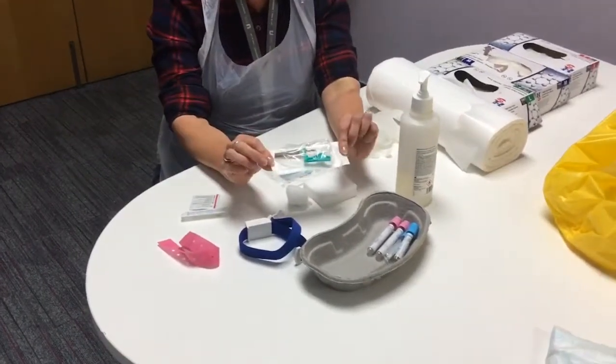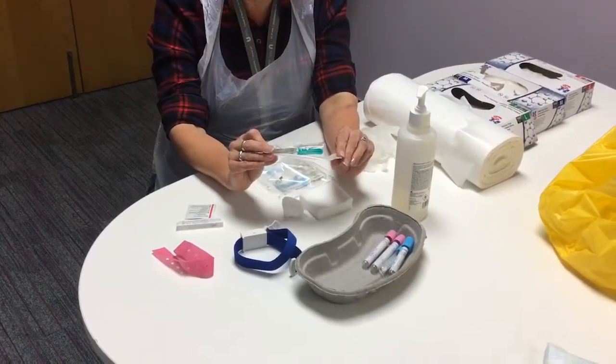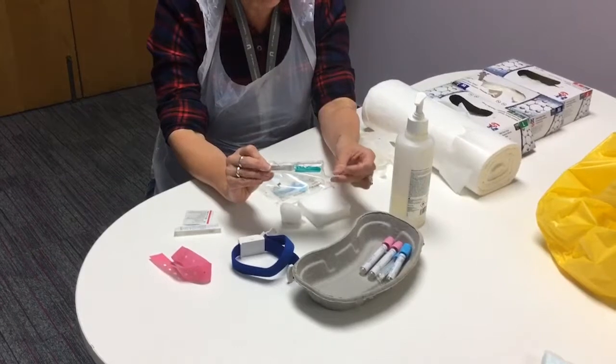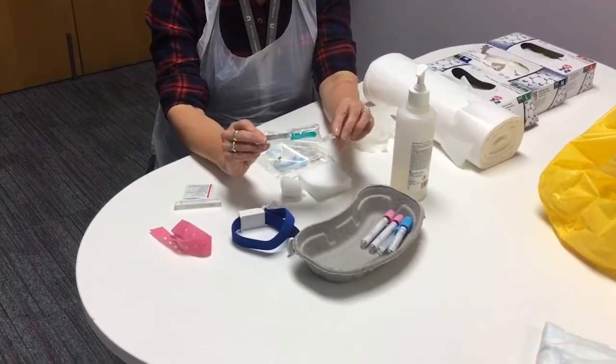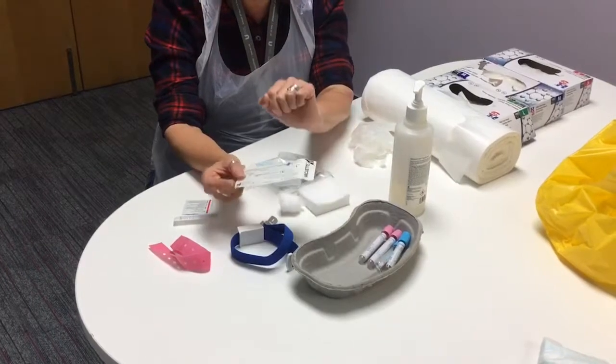Exactly the same with your vacutainer — check that it's in date, packaging is sealed, and before you actually use it, check that everything is in working order. Check your expiry on that as well and that it's all okay.